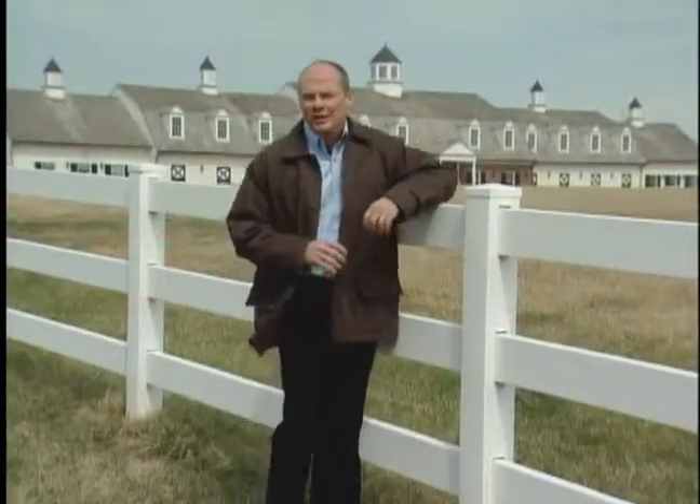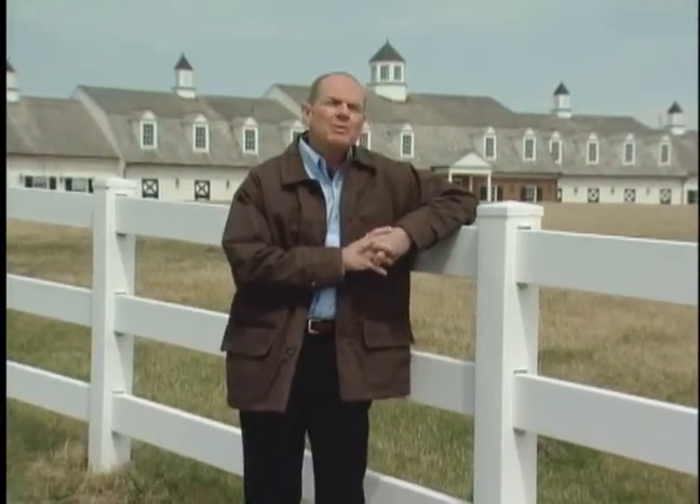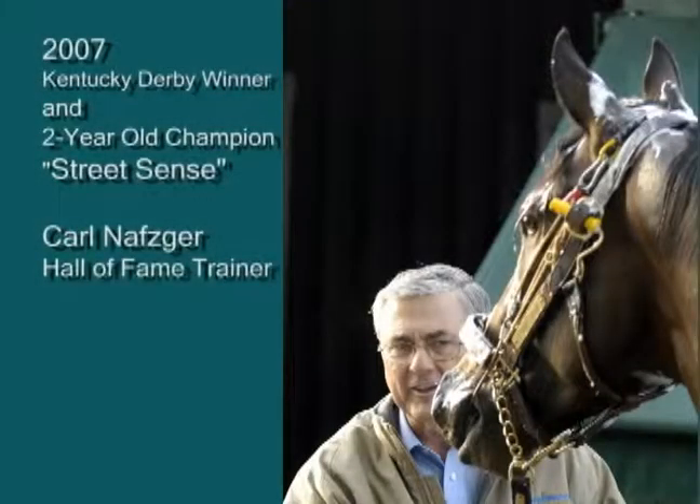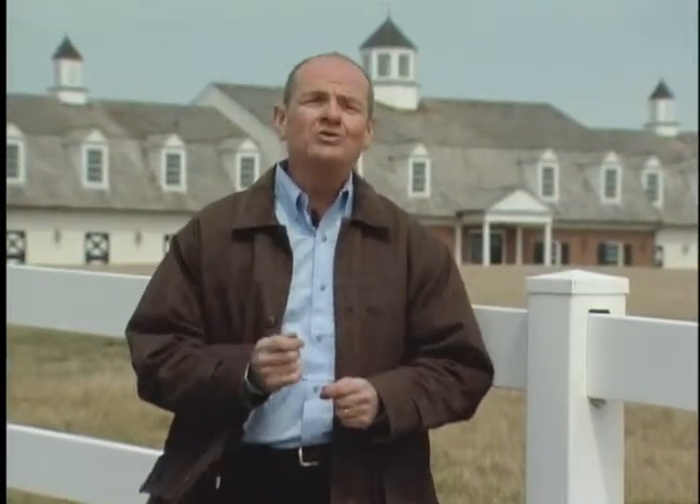The uses for the Stabilizer system are almost unlimited, and so is the number of satisfied users, including premier horse farms, horse owners, trainers, and veterinarians from around the world. Whether you own one horse or run a large equine operation or practice, the Stabilizer system delivers the greatest level of control, comfort, safety, ease of use, and trainability in the most humane equine restraint available.